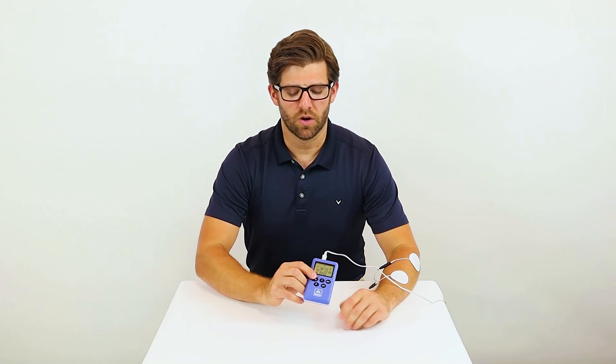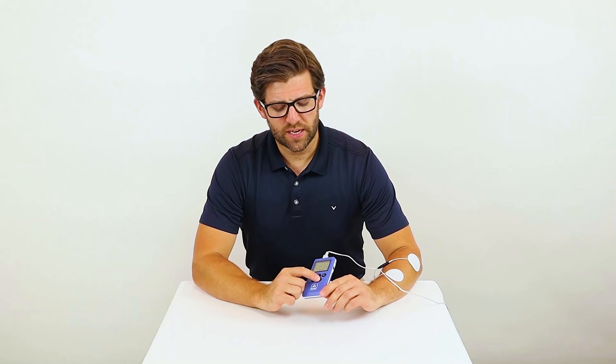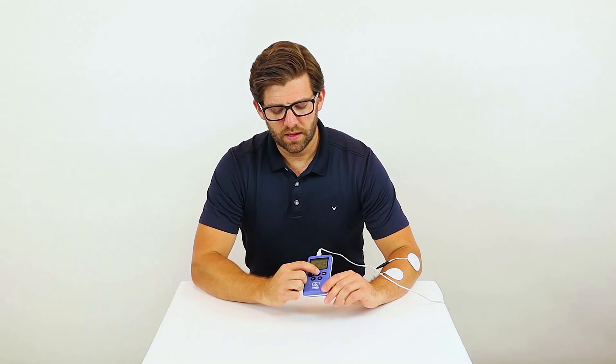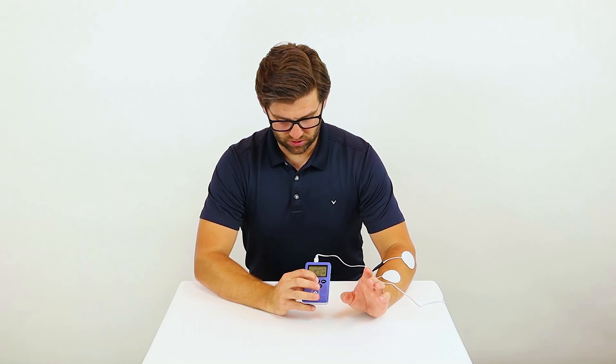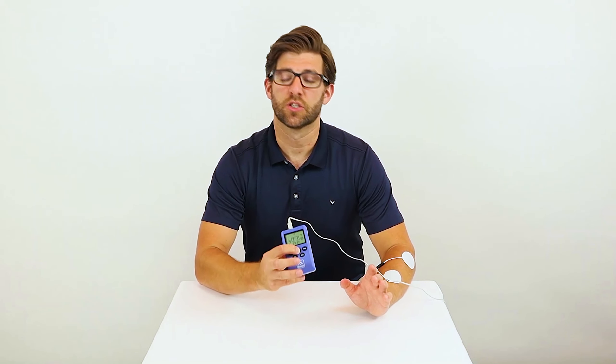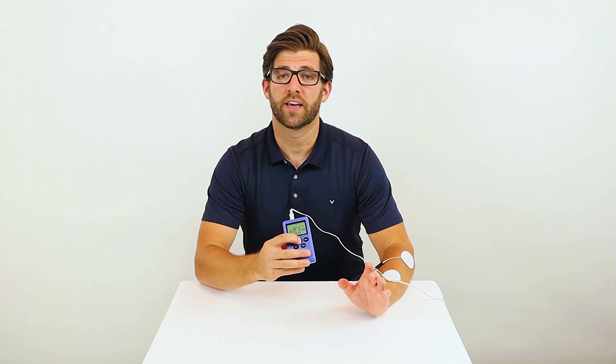If you would like to use the trigger mode, push the channel button again so that A is blinking, and then hit and hold the trigger button for 3 seconds. You'll see an arrow light up underneath the channel, whether it's A or B. And now I'm getting stimulation as long as I'm pushing that trigger button. When I let go, it shuts off.